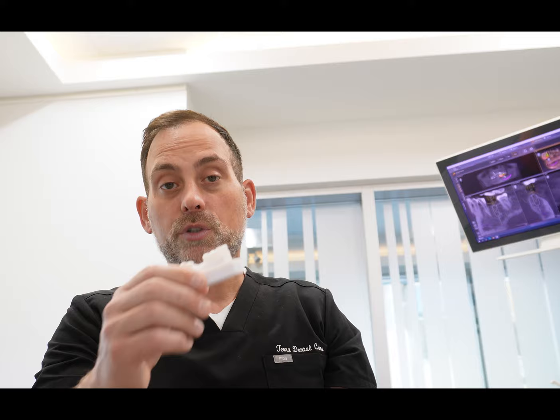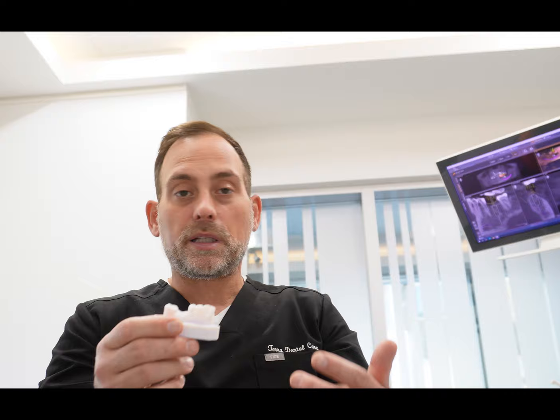Good afternoon, my name is Dr. Mike Perchewski and I'm here with the DWD podcast team. Today we're going to present placing a guided Astra implant into an anatomically correct surgical model that was 3D printed with the help of Dr. Josh Eggebretti. This model was created in multiple layers so it simulates cancellous bone, cortical bone, and also has an overlying gingival tissue that can be cut or tissue punched to simulate actual implant placement.